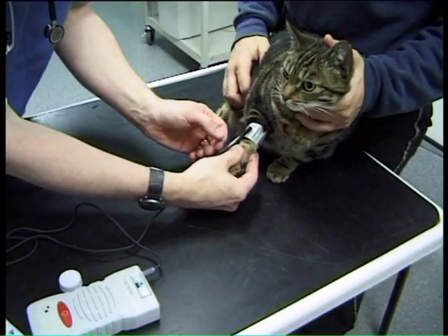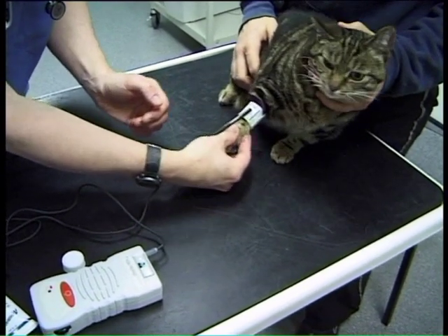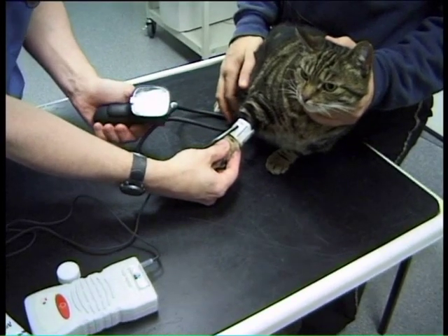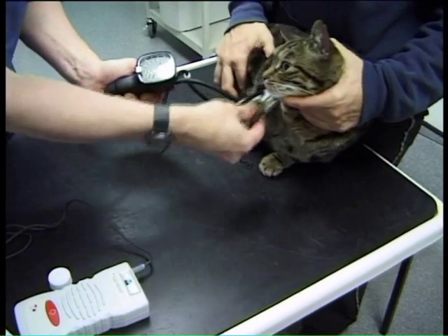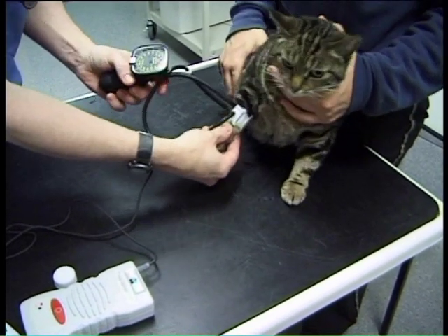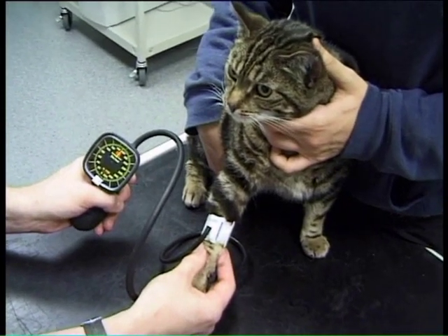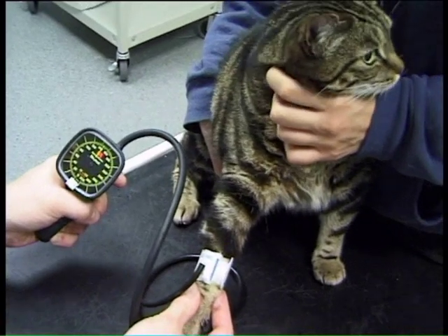The position of the probe just needs to be gently altered until you can hear the flow of blood. Once you get a clear signal, we then gently inflate the cuff to the point where you can no longer hear blood flow. And then slowly allow the cuff to bleed down. The point where you first hear the blood flow again is systolic blood pressure.